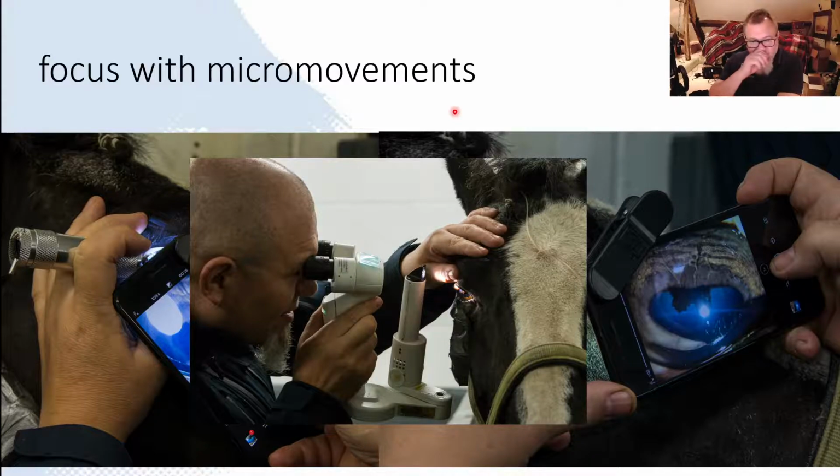And just to remind you, this is exactly how the slit lamp works. We use magnification and light obliquely from the side. So with the slit lamp, we rely on oblique illumination to get the three-dimensional view of our patient's eyes.